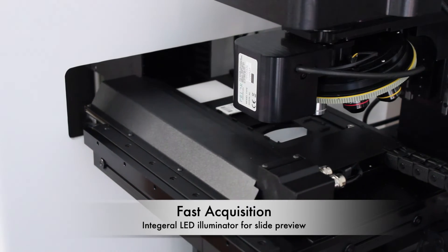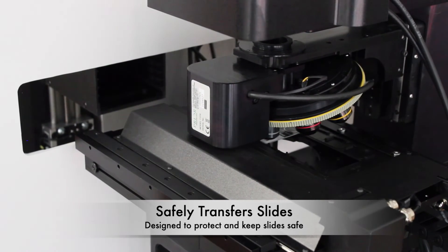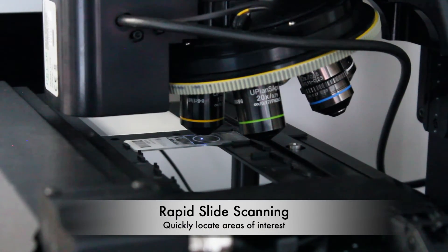This low-magnification preview scan quickly locates the areas of interest, so you only scan what is necessary. A retaining mechanism within the hotels maintains a firm grip on your samples, keeping them safe during transfer to and from the SL160 loader.